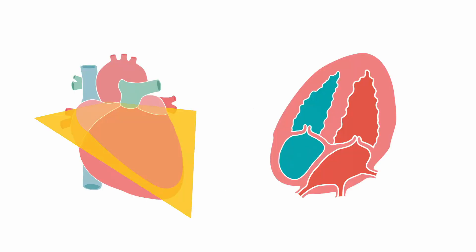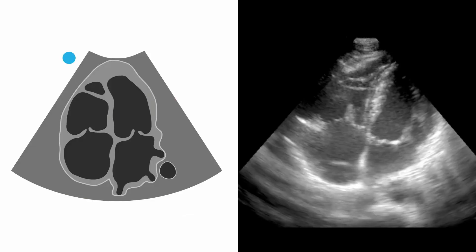Your image should have an orientation like this: the right and left ventricle on the top, the mitral valve, your left atrium, your right atrium, and your tricuspid valve. Here's your ultrasound image — again, right ventricle and your left ventricle, your mitral valve, your left atria, your right atria, and your tricuspid valve.